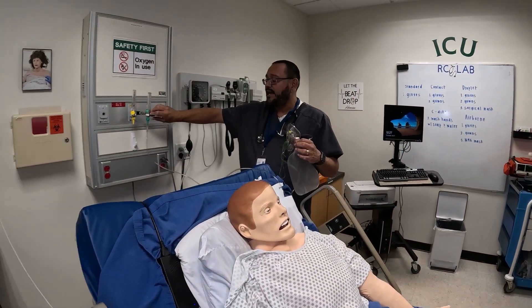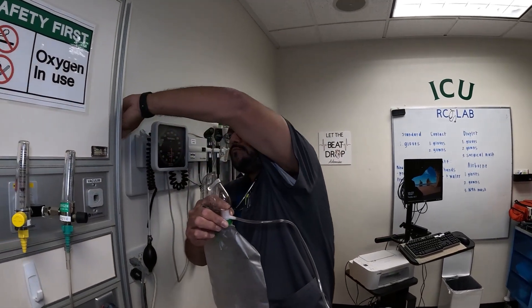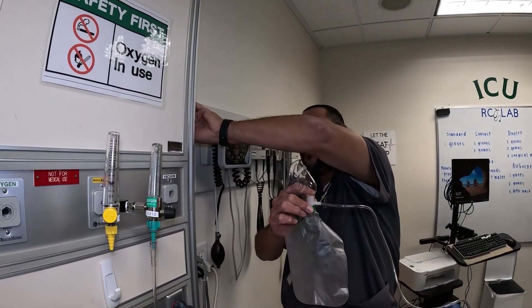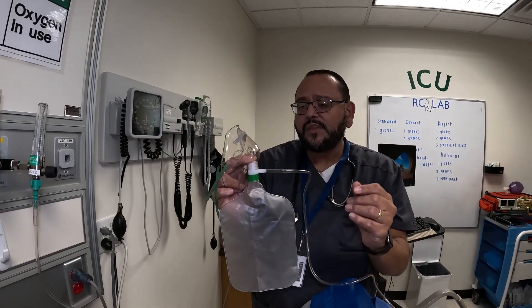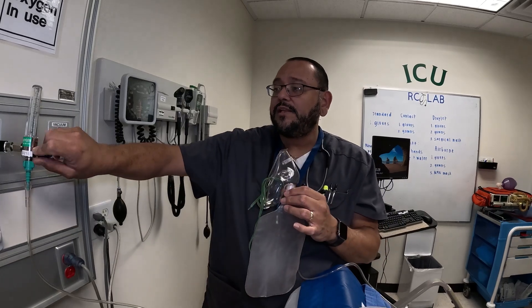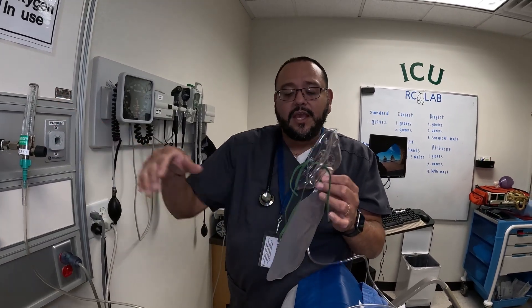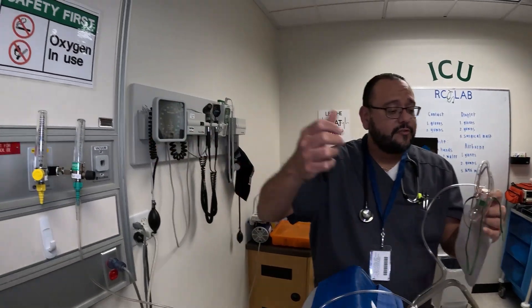You want to go to 10 to 15 liters. Hold this part down — with the one-way valve it helps inflate the bag quicker. Once the bag is fully inflated, if it's collapsing a little bit when you put it on the patient, that means it's not meeting the patient's inspiratory drive or ventilation requirements, so you would need to go to 15 liters or flush.